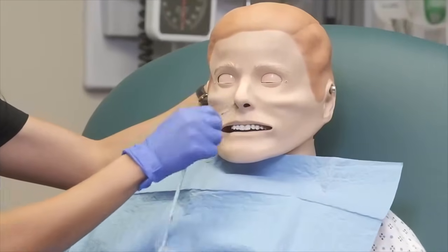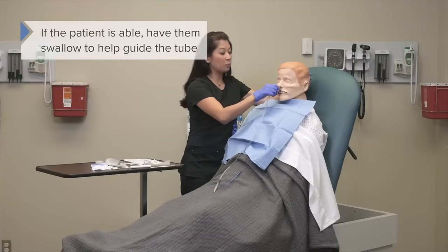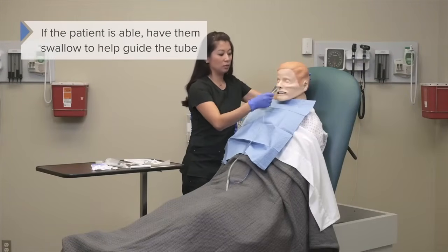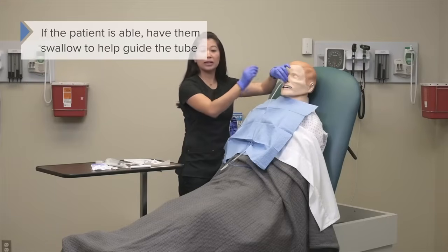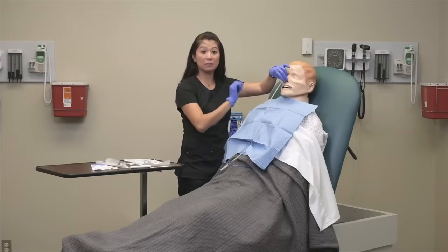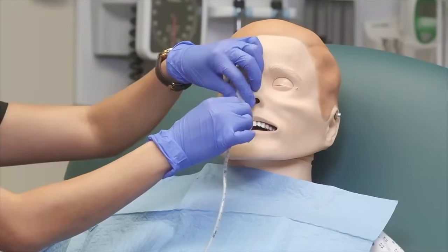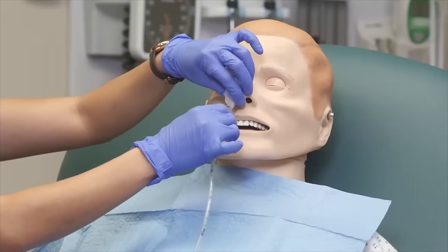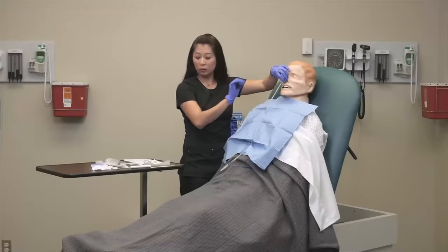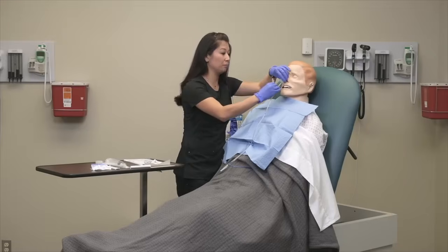And we're going to advance the tube. Notice I'm going in a very smooth fashion. I didn't go too slow, it advanced smoothly, so I'm going to keep going. Now you see here why I like to mark that tube, because without having to watch, I can just keep going if my patient can tolerate it. Now, here is what I like to do before I lose my tube: I want to secure it.